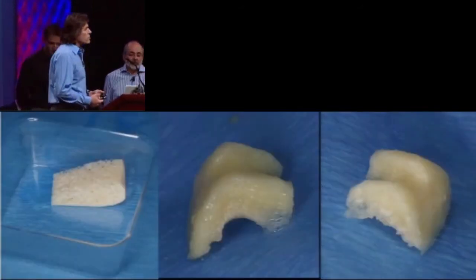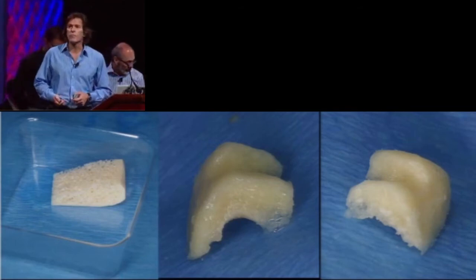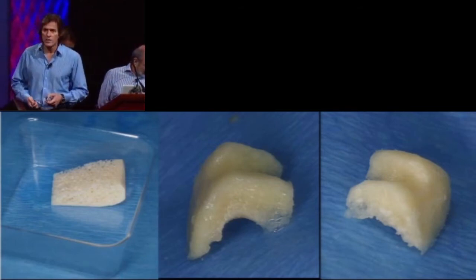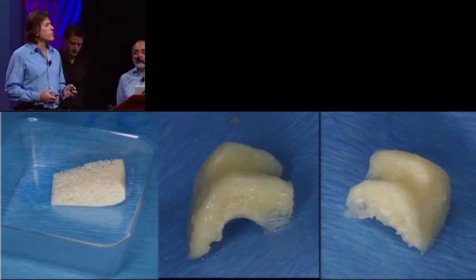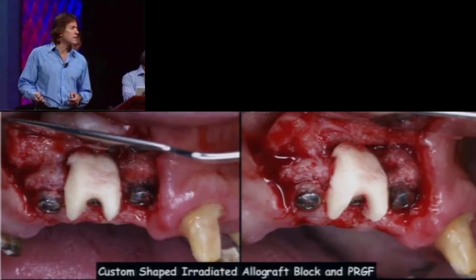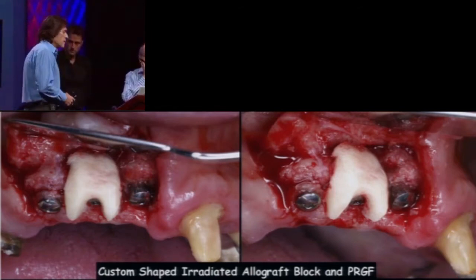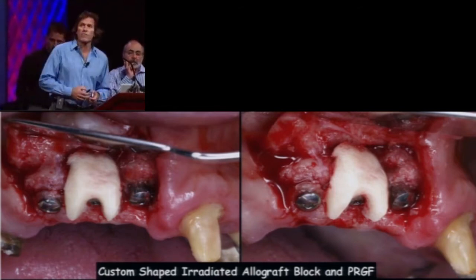We can deal with these in a number of different ways, and our intent was to show you different modalities. In this case, the patient did not want to go through autogenous block grafting. We did not have access to BMP at the time. We utilized allograft block, and we shaped it over the ridge to support the area between two implants, just in the pontic space. And we screwed this in with a bone fixation screw vertically. And this can be pre-fit on a stereolithographic model today.